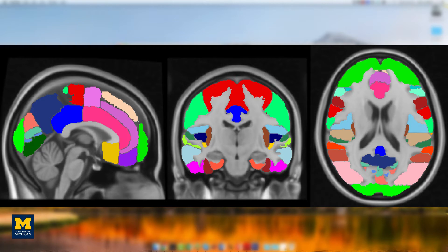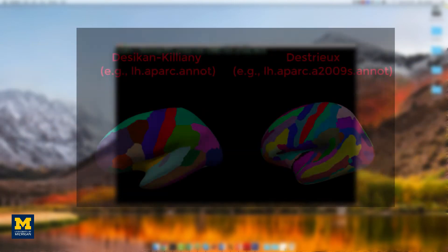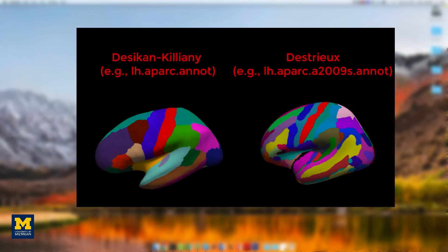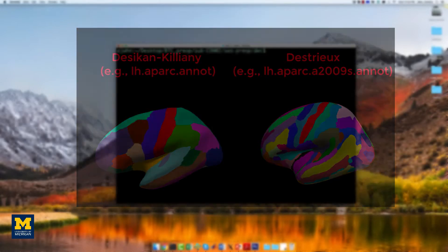You can use any atlas you want, but for this tutorial, we will be using the atlases that come with FreeSurfer. Accordingly, our first step will be to run the subject's anatomical image through ReconAll, which you can read more about in the link down below.